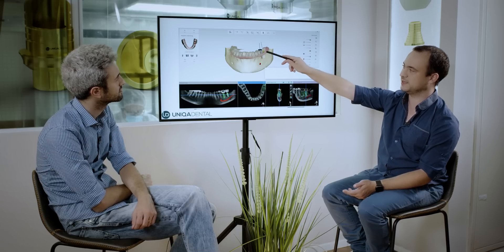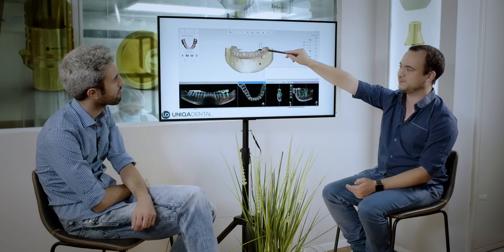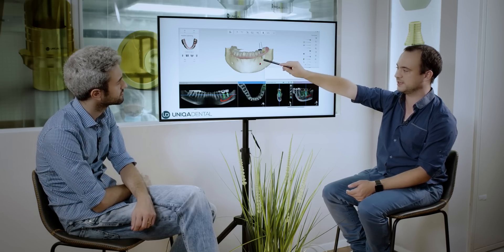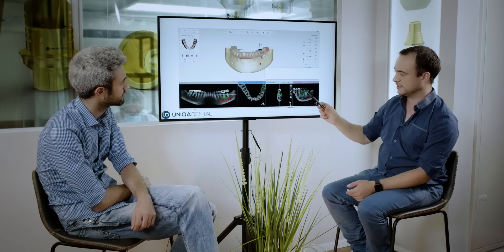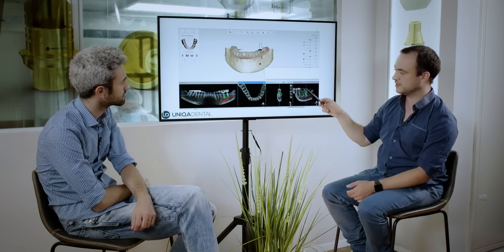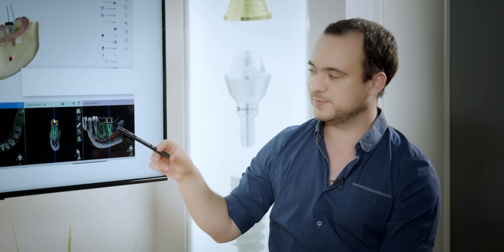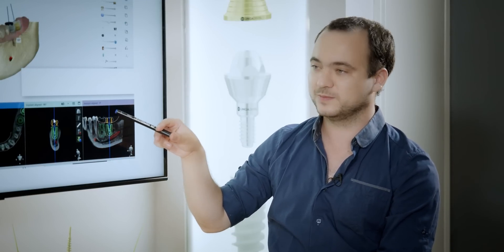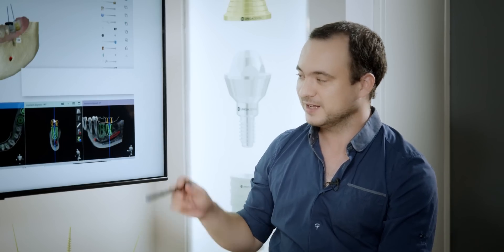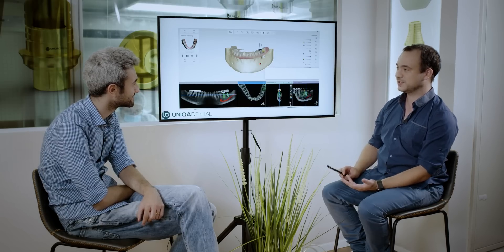So in here I see both of the crowns I designed — these are the crowns of the patient. This is his CT. And in here I can see how to place the implants. I know that the crown is supposed to be in this area, so the implant should be below the crown — that's the best place for the implant. So I know the angulation, I know the position, the best position of the implant.